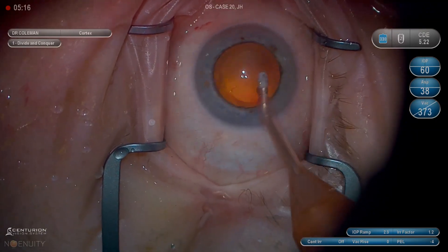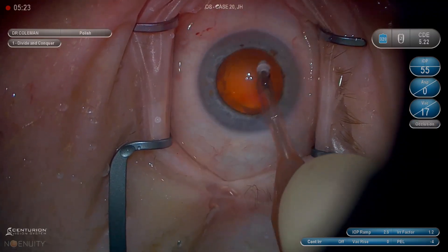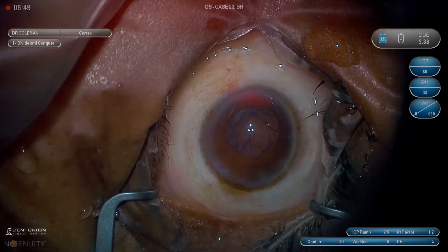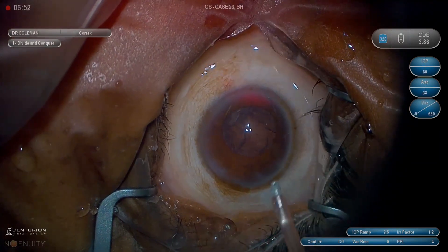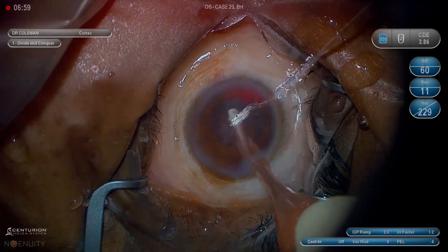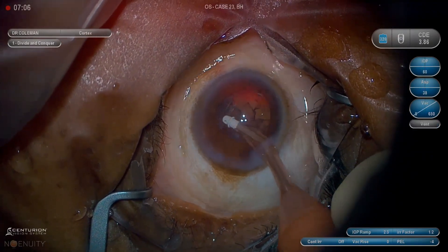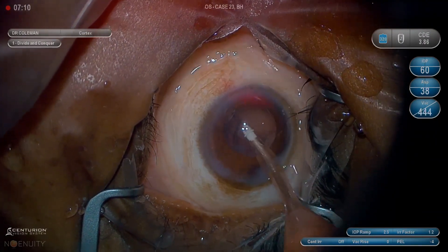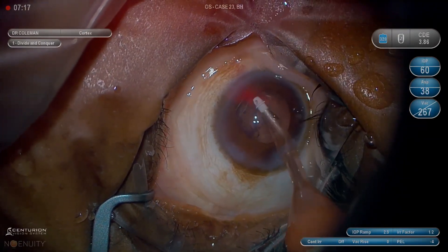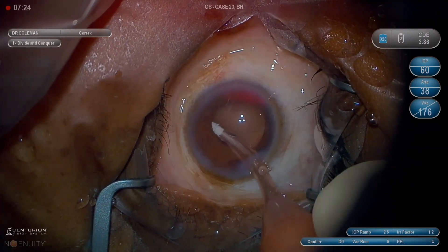You just saw there in the polishing where I engage a little bit of capsule. As I'm polishing — and really as I'm getting cortex, especially sub-incisional cortex — you're not necessarily looking where you're grasping. You're looking in the center of the red reflex to watch for capsule wrinkles. That's when you need to let go. Be very familiar with how to reflux with your foot pedal, because the eye doesn't always let go on its own. Know what reflux is and use it — it'll spit the capsule back out. Here we're taking sub-incisional cortex, and I'm trying to go in areas that do not have open capsule next to them.